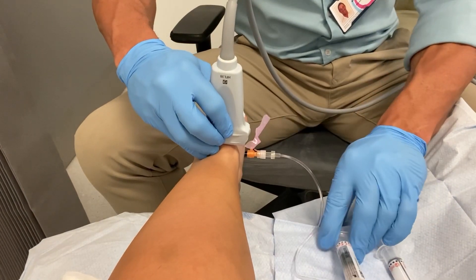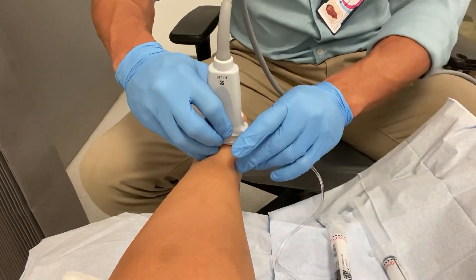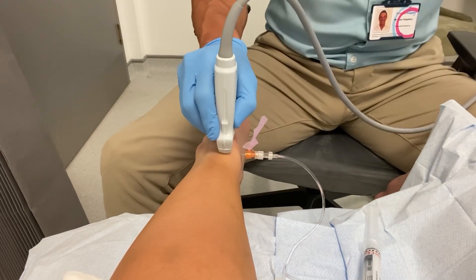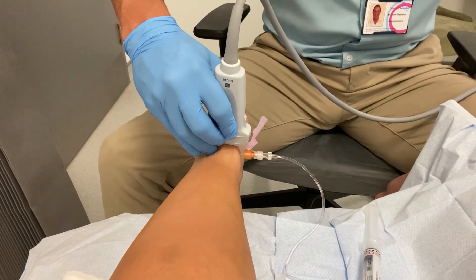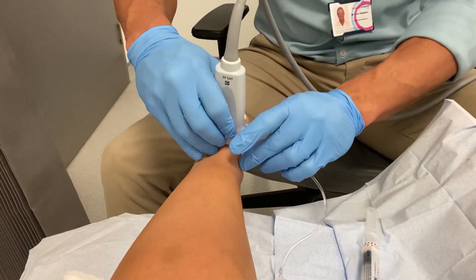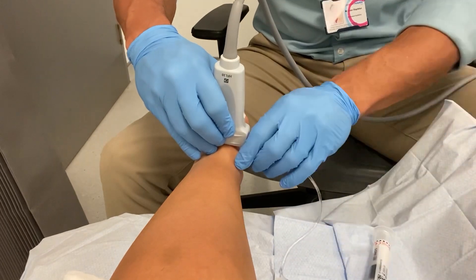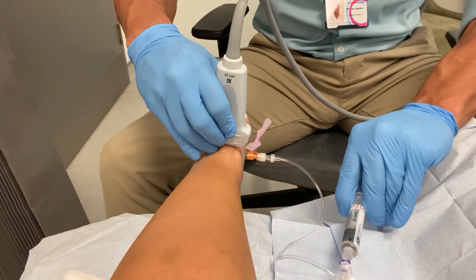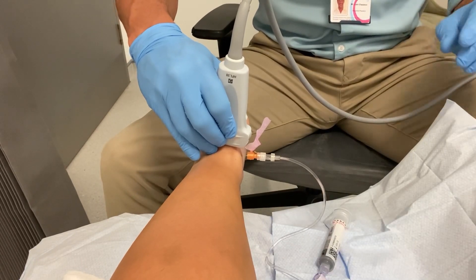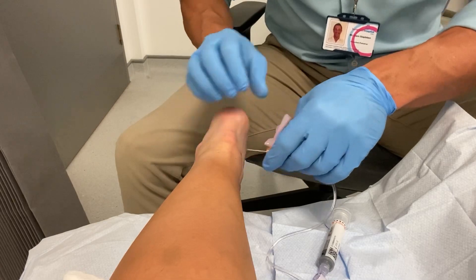I've sped up this video a little bit so it doesn't take quite as long. Essentially what I'm doing is very slightly moving the needle to different areas of the Achilles tendon, using initially some local anaesthetic, then some corticosteroid, and then just plain saline water. We're stripping the Achilles tendon of any adhesions to it, and that's the injection done.